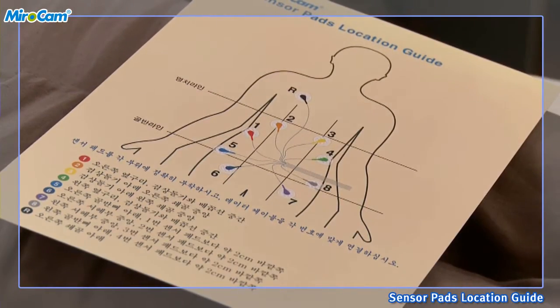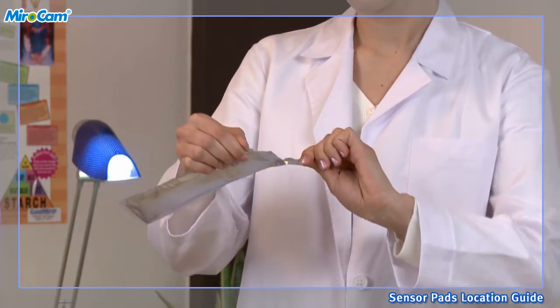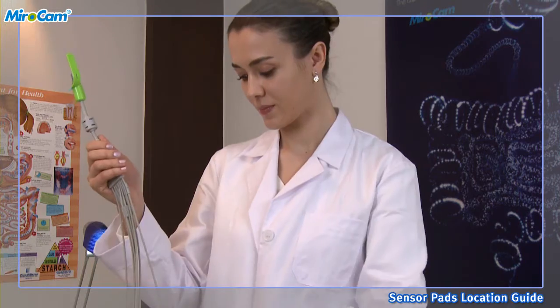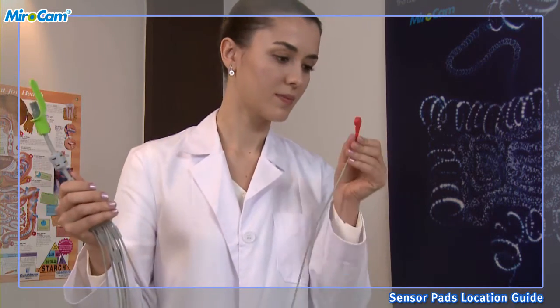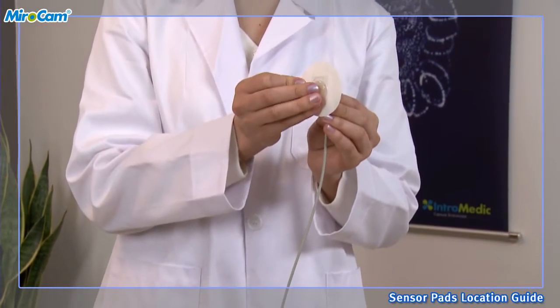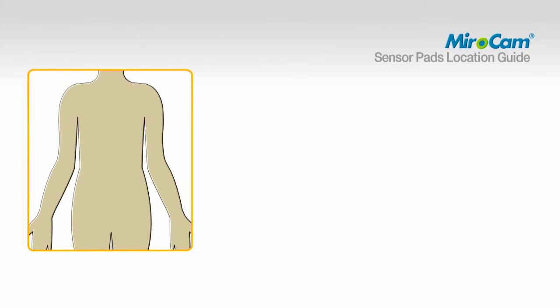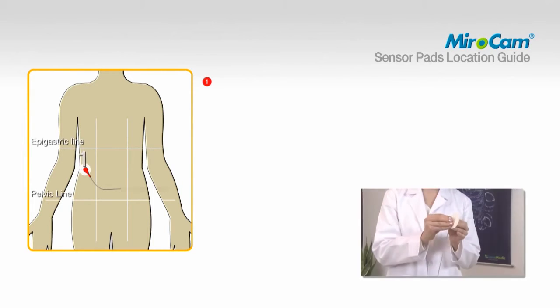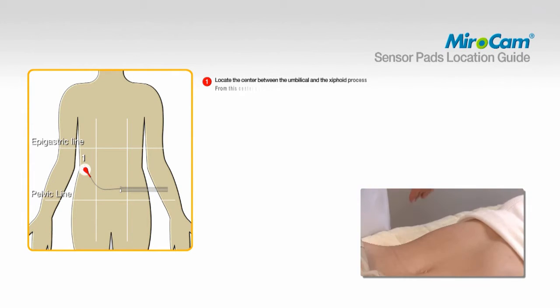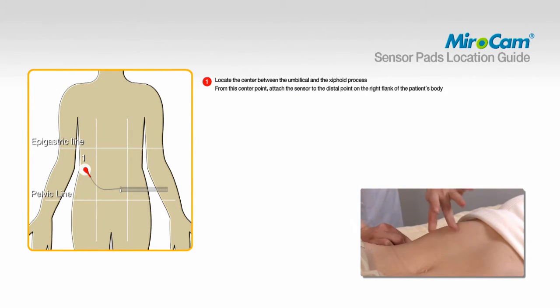Open the bag of sensor pads and attach them to the data cables prior to affixing to the patient. Attach sensor pads according to the color and number on the data cables. To attach pad number one, locate the center between the umbilical and the xiphoid process. From this center point, attach the sensor to the distal point on the right flank of the patient's body.